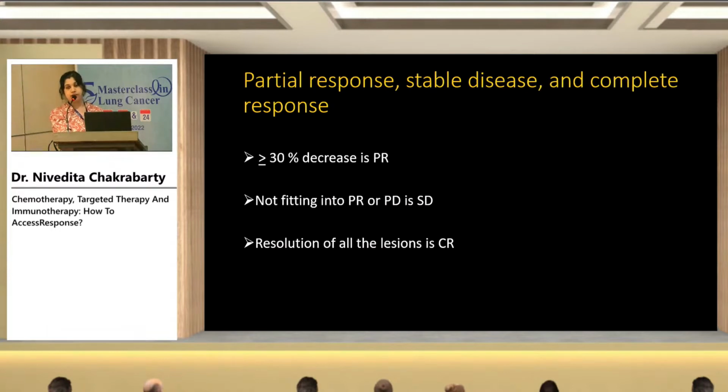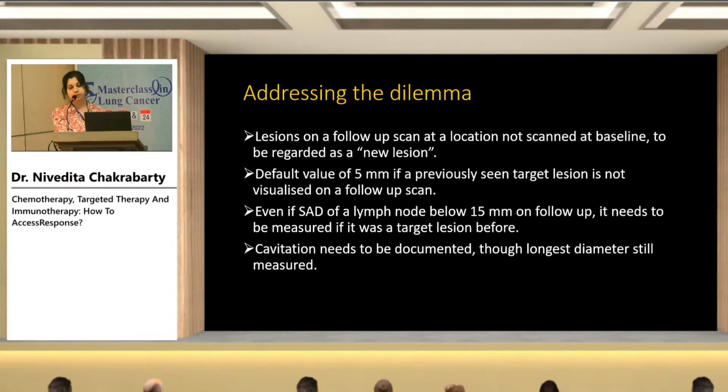Now, if there's a more than or equal to 30% decrease in the lesion size, then it's a partial response. If it does not fit into partial response or progressive disease, it is stable disease, and resolution of all the lesions is considered as complete response.